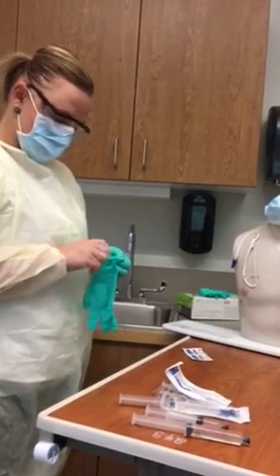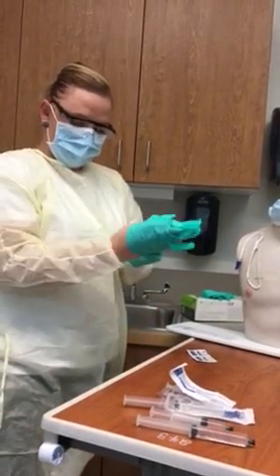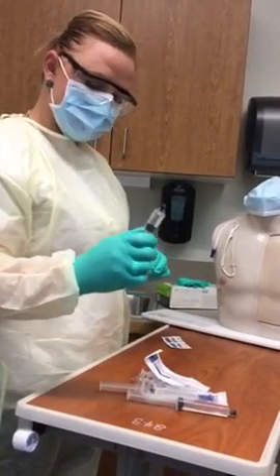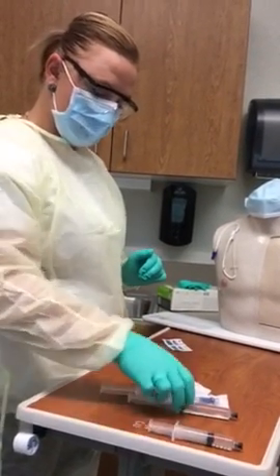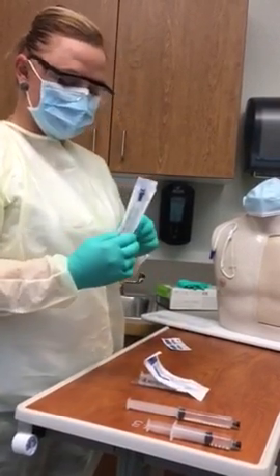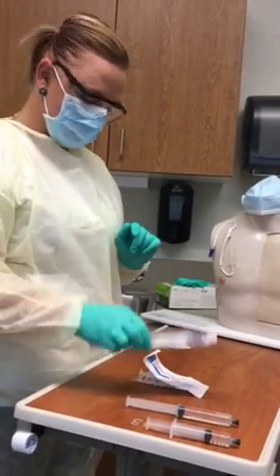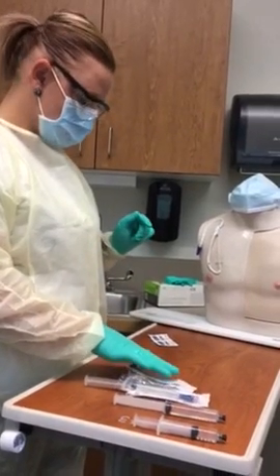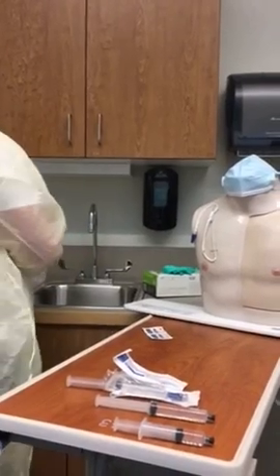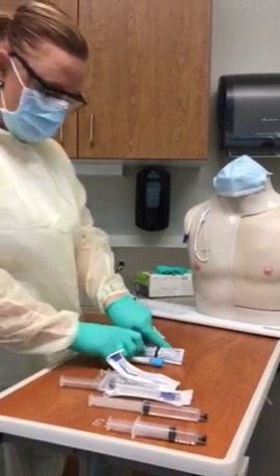All right. So what I have here is one 5 cc syringe full of heparin, a 10 cc syringe full of normal saline, another 10 cc syringe full of normal saline with a cap that's been pre-flushed, and then my 2 syringes to waste blood and draw the blood. And I also need my needle.